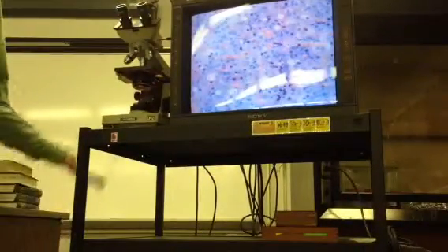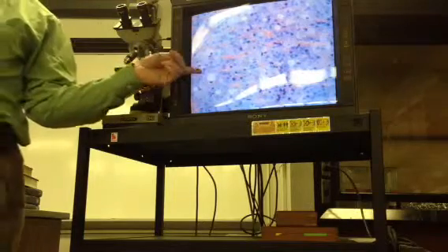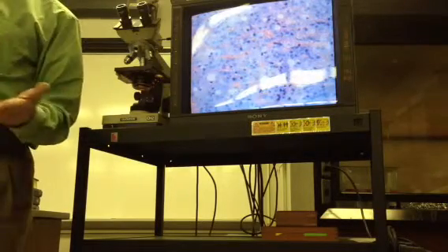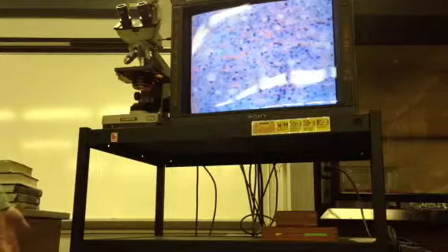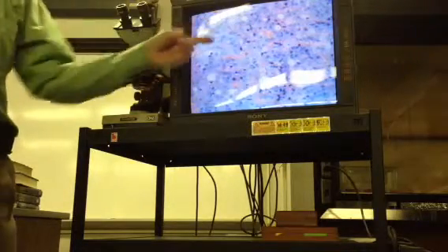They appear empty because it's just oil. When the slides are made, the same way you made the slides of the breast, they go through a lot of immersion in xylene, which is a very nice solvent for dissolving fat, and paraffin. And so whatever was in those lipid droplets gets extracted, so they not only look empty, they are empty by the time you see them. But to see these lipid droplets and these capillaries is very typical of fasciculata.